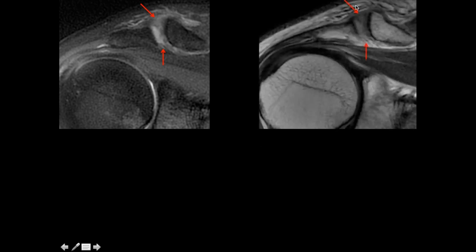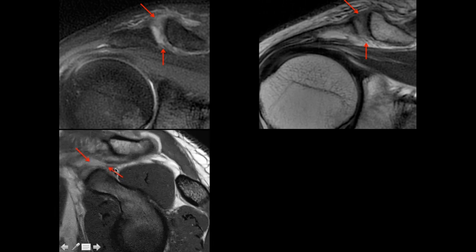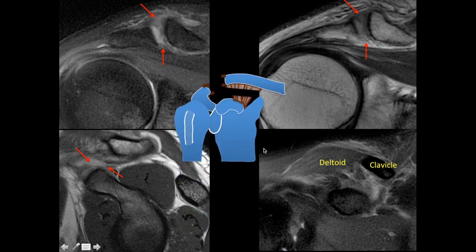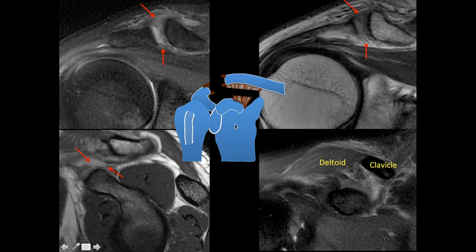In this case there is high-grade injury to the acromioclavicular ligaments. On the sagittal image there is a discrete tear of the coracoclavicular ligament at the coracoid attachment, and there is also edema in the deltoid towards the clavicular attachment. This is injury to both the acromioclavicular and coracoclavicular ligaments: Type 3.